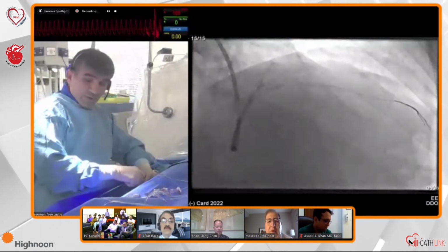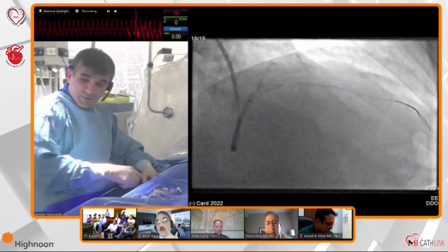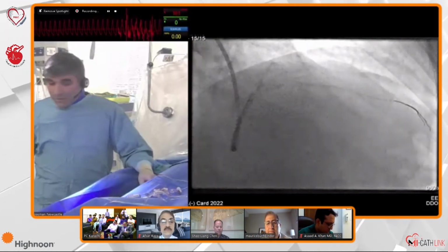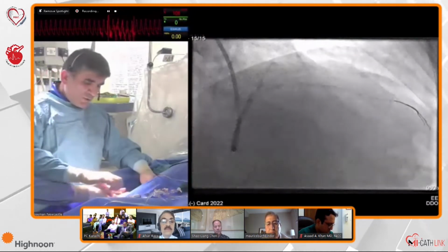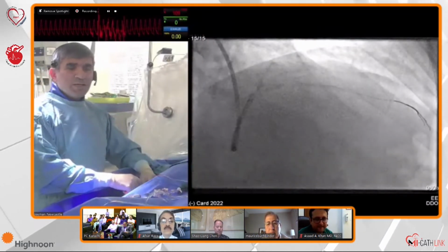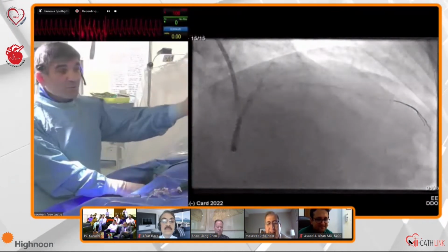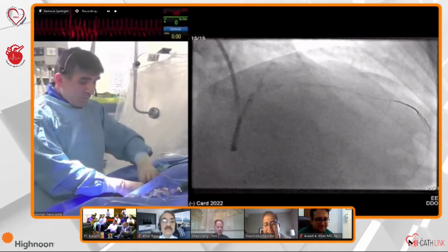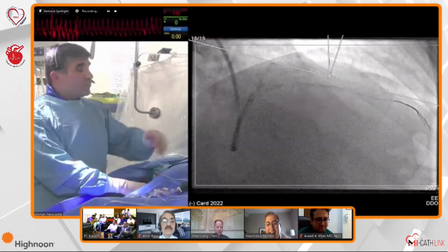Totally agree with you. We've been doing it exactly that way. It's a very good way of ensuring it, because I hear this phrase, "Oh, nail the ostium," and angiographically, there is no chance in hell that anybody knows where the ostium is, the majority of the time. On occasion, you might. You're looking at a 3-dimensional structure in a 2-dimensional image.